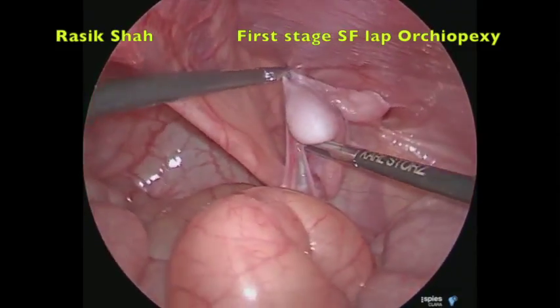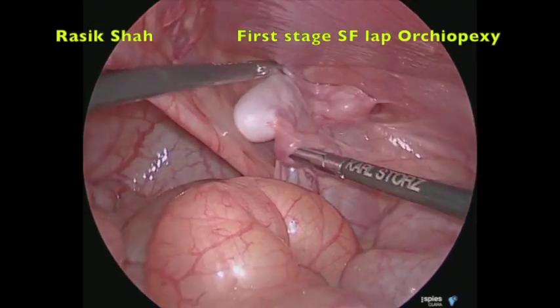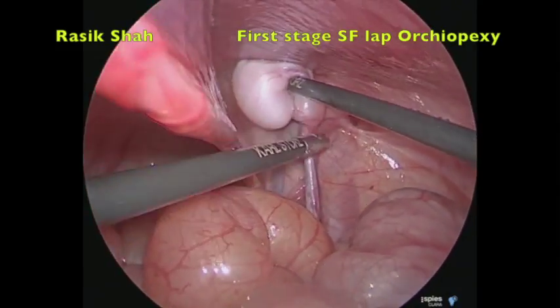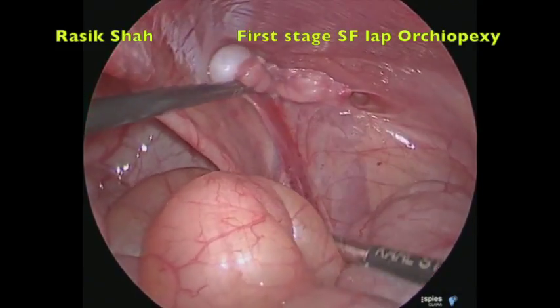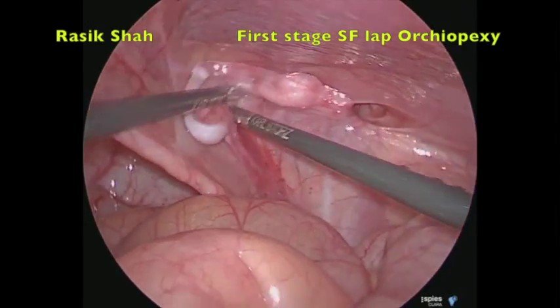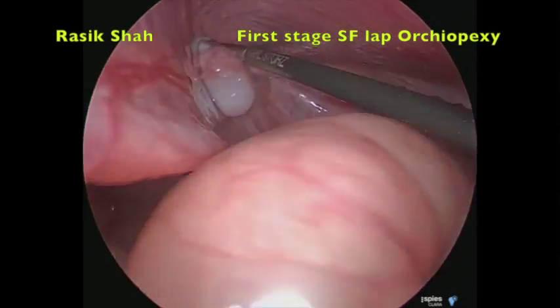The second point is the mobility of testicular vessels. In this patient, by pulling the testes towards the scrotum, the testicular vessels are very tight, and the decision is taken to do staged orcheopexy. This testes, even if it comes down in a single stage, the testicular vessels will be under tension.